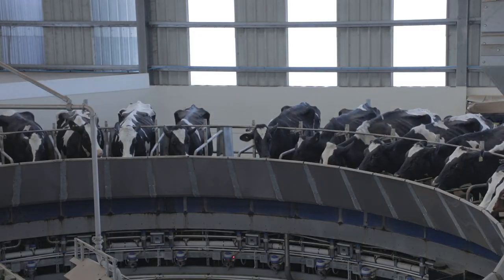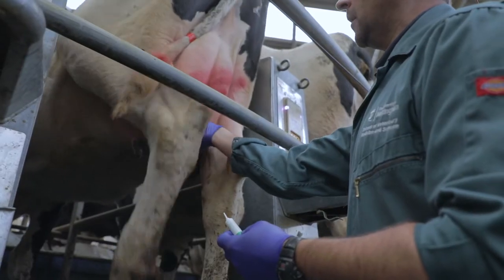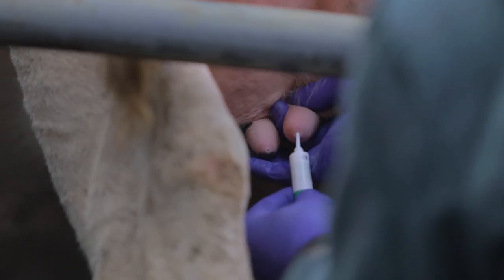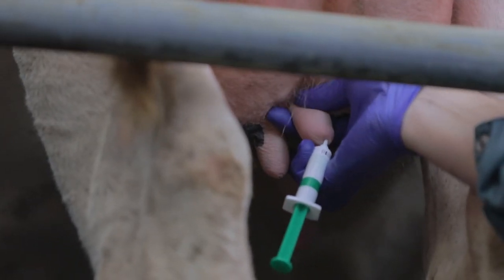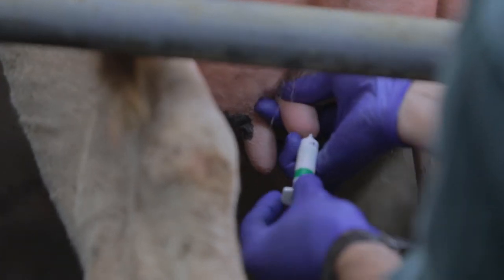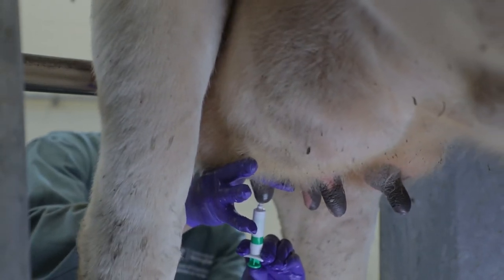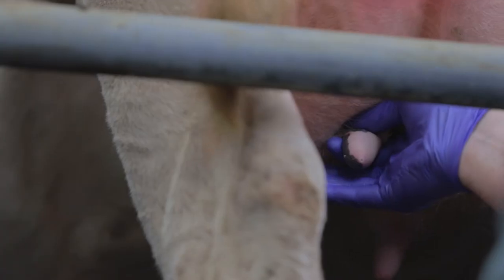We're going to administer the teat sealant in reverse order, starting with the back right teat, which was the last teat we prepared — so the closest teats to us. Partial insertion of the nozzle — you can actually hold it with your little finger if it helps. Notice I'm gently pinching the base of the teat to ensure the teat sealant remains within the teat system, then just letting it go. No massage at all of the gland.